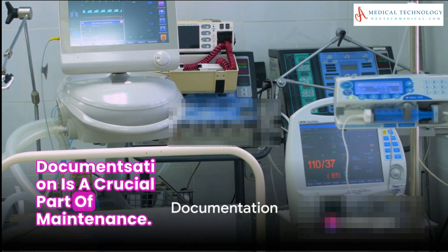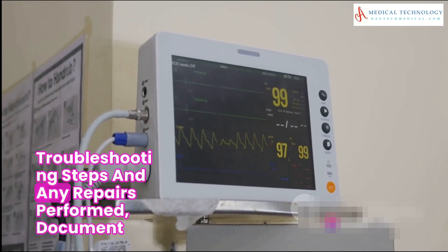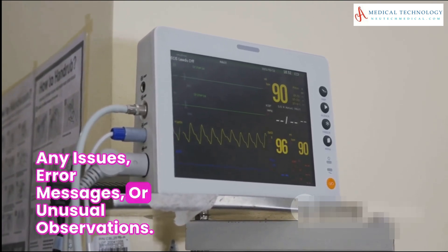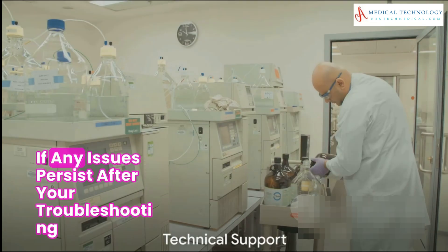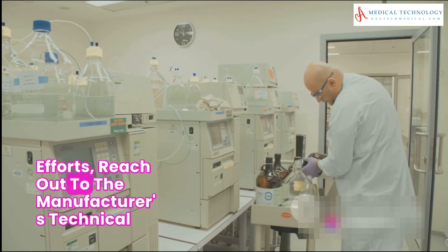Documentation is a crucial part of maintenance. Keep detailed records of all maintenance activities, troubleshooting steps, and any repairs performed. Document any issues, error messages, or unusual observations.